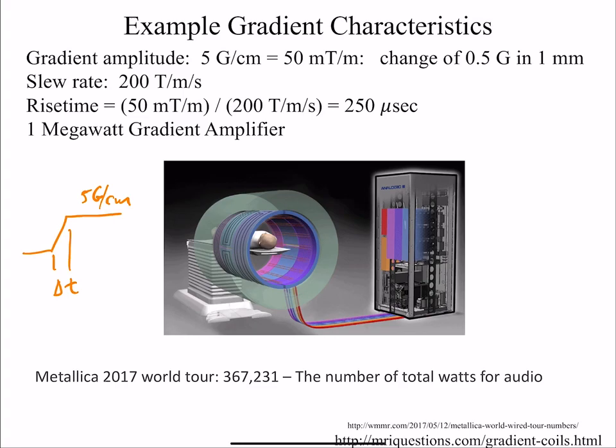And so that's why you can actually hear it. And for certain sequences, you actually feel it. There are certain designs. If they haven't designed it well to be sort of all force balanced, it sometimes feels like you're in a washing machine. It's just like that. Okay.